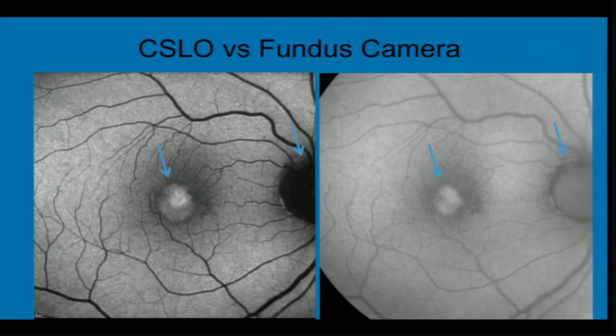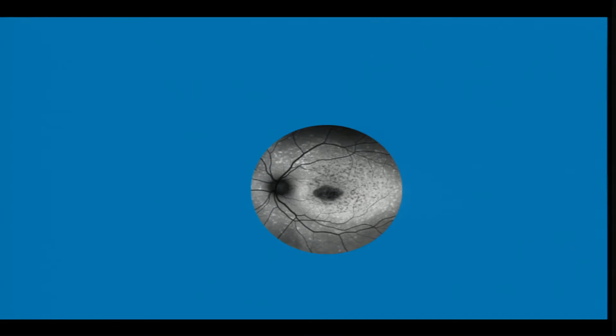the fundus based cameras. The third platform is Optos, which can again give us insights into various disease mechanisms. So this is the central part which is seen on autofluorescence, and this is a patient with Stargardt, central hypo and then peripheral flecks. The central flecks are hypoautofluorescent. As we go to the periphery, the flecks become hyperautofluorescent.